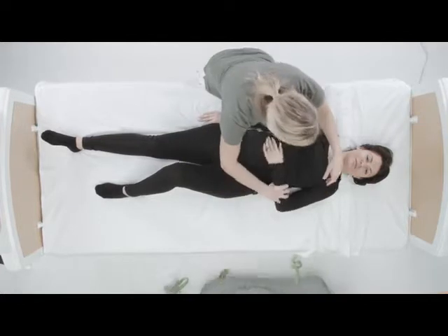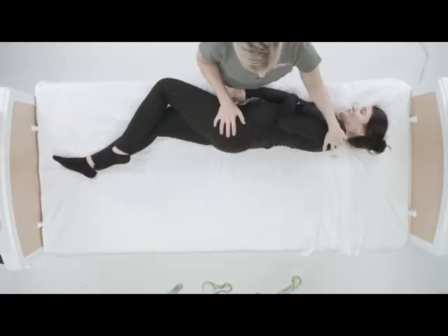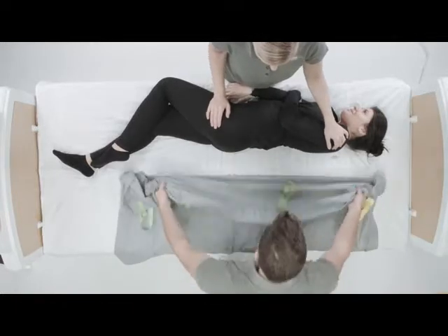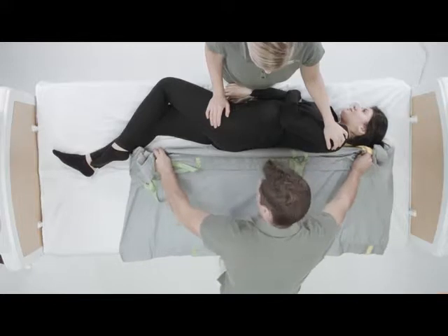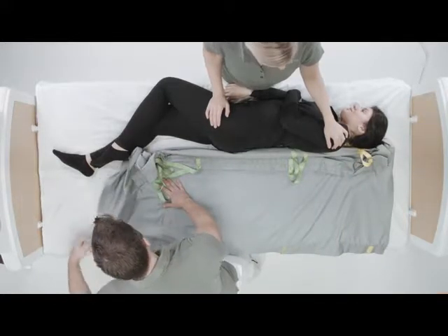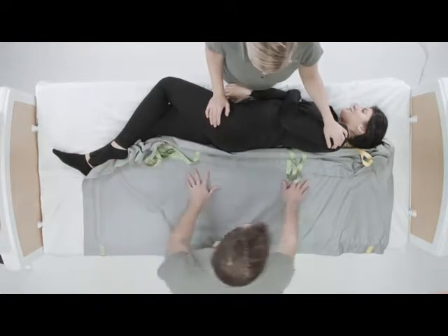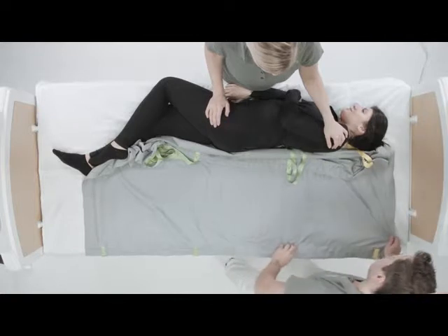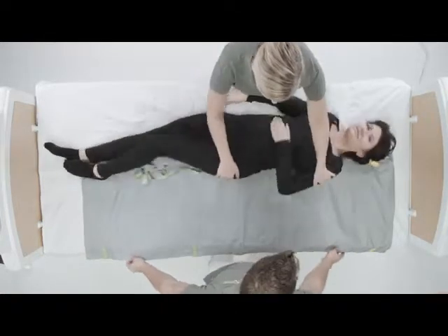To apply the sling, gently roll the patient onto his or her side. Place the sling on the bed beside the patient, keeping one side of the sling even with the edge of the bed. You can line up the sling slightly above, 1 to 2 inches, the top of the patient's head. Gently fold straps under and begin to press down on the edge of the sling and slide under the patient.